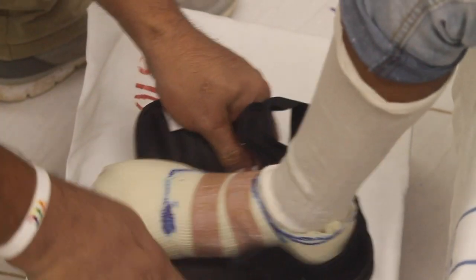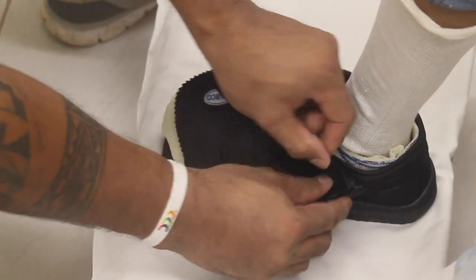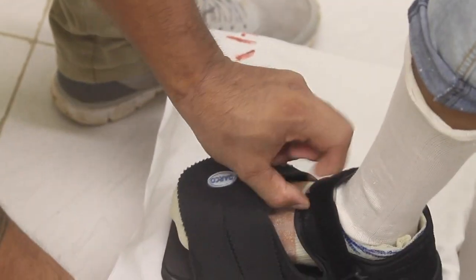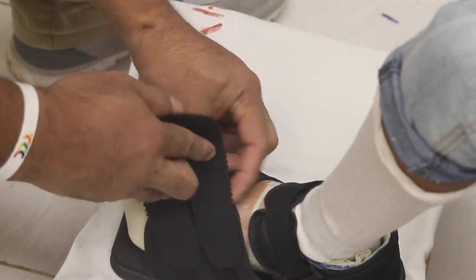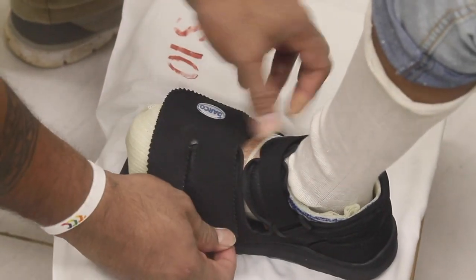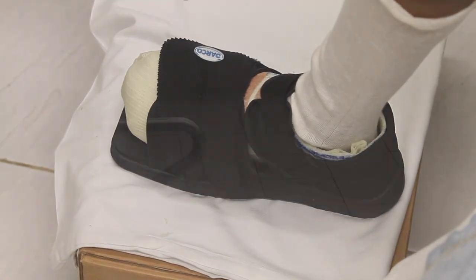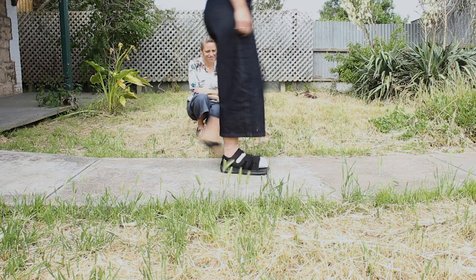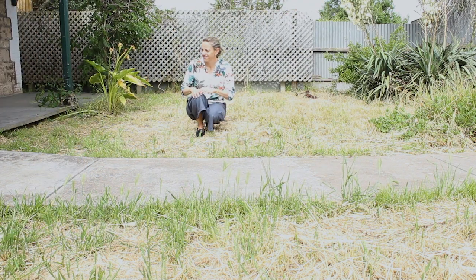Fit a canvas rocker or Darco post-op shoe. Review the client walking in the shoe. Consider using EVA wedges in the shoe to optimise gait or walking pattern. Watch the person walking 20 to 30 metres and ensure they are stable and comfortable. Use a corridor or open space to allow proper observation. Watch to ensure there is no slipping of the device.